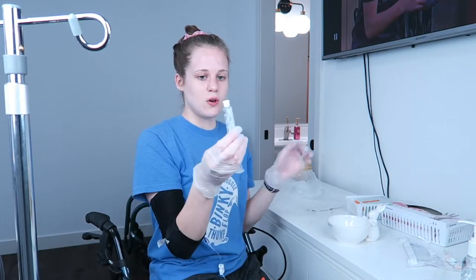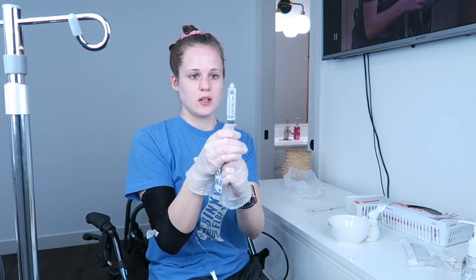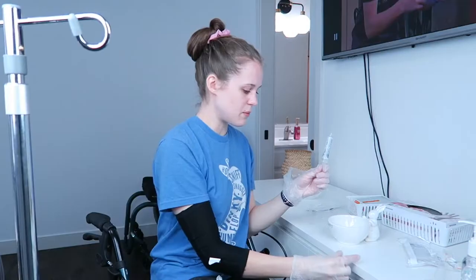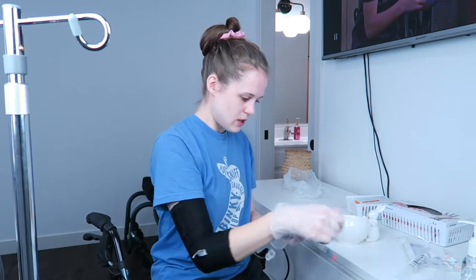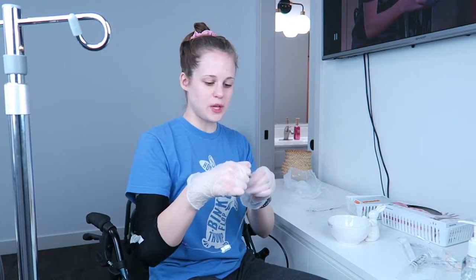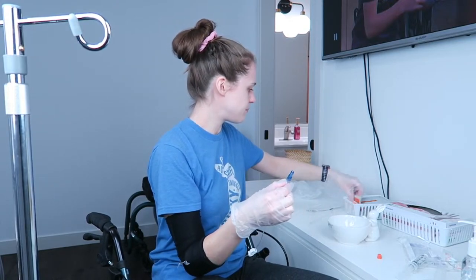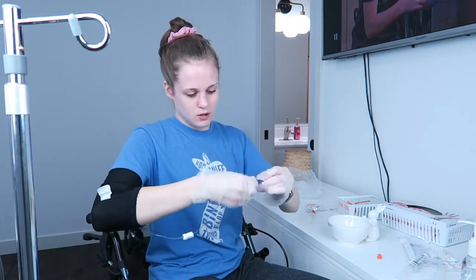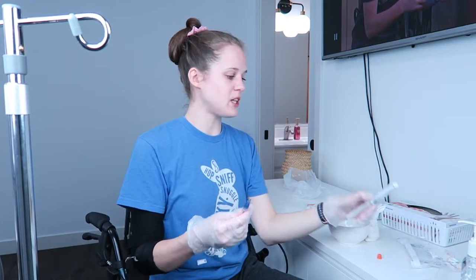I'm going to go ahead and prime this. So this is the saline flush. You need to flush your line before you use it to check for blood return. You pull back like this to get the air in, and then you push all the air out. Then because I kept the cap upside down, I can put it back on, set this down. Then I'm going to take the swab cap off of the end of the line, and I'm going to take an alcohol swab. You just take it, twist it, then just let it air dry for a little bit.